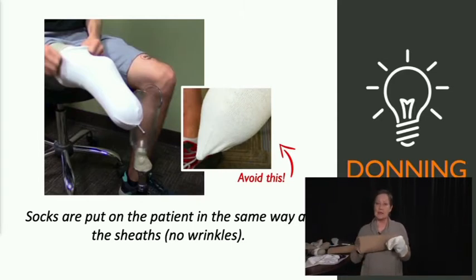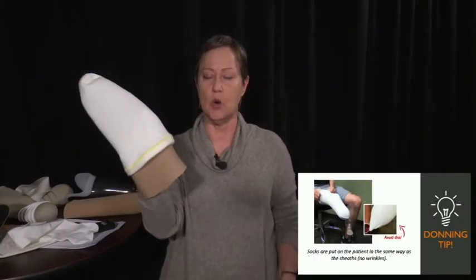I can't tell you how many patients I've had who come in to see me. They got their leg a day before. They proudly walk in. They have a sock inside the liner. Talk about wound setup, right? So you're going to get shear and friction, moisture. It's a bad recipe. So the sock always goes over.